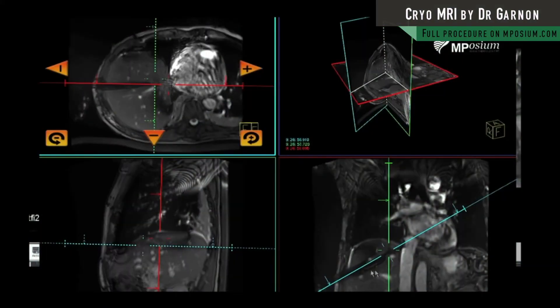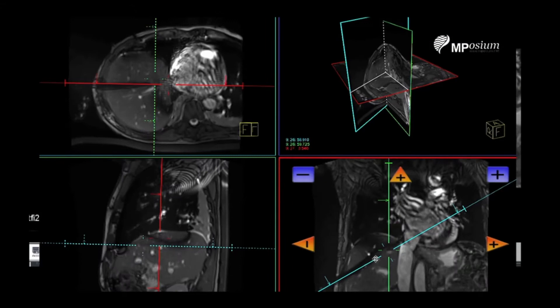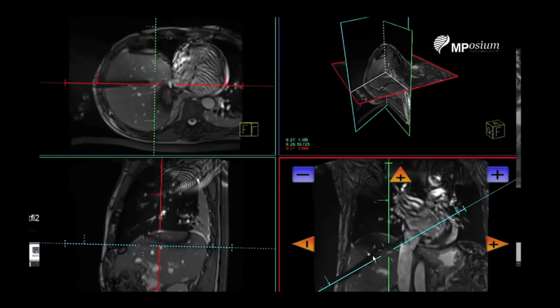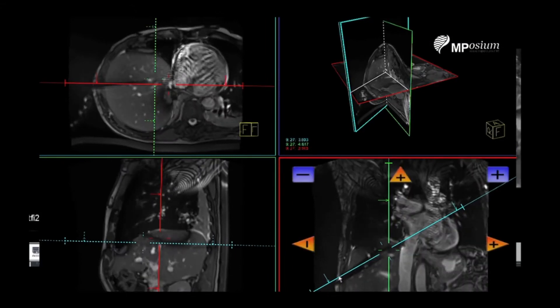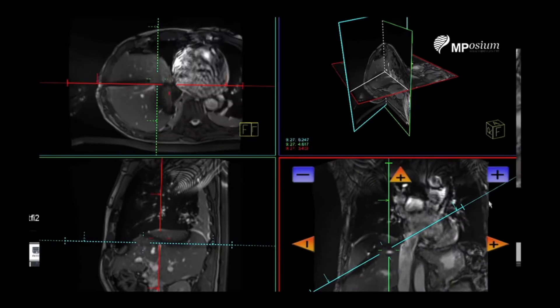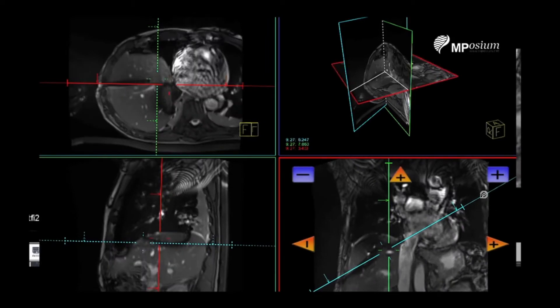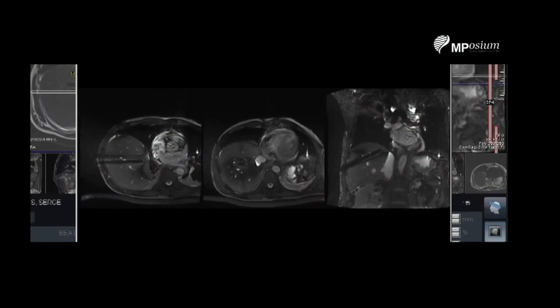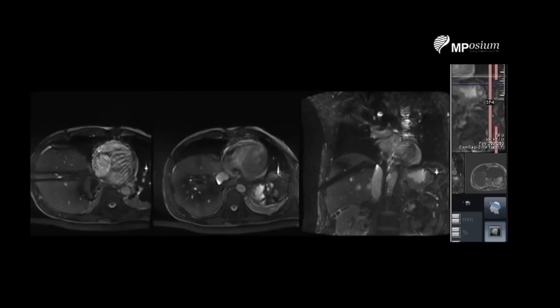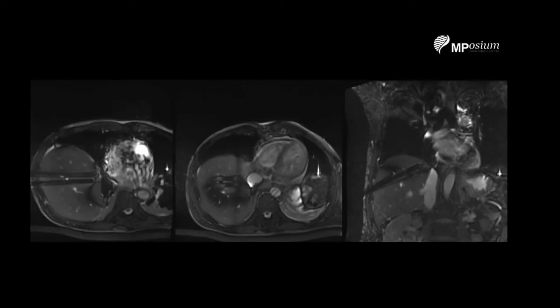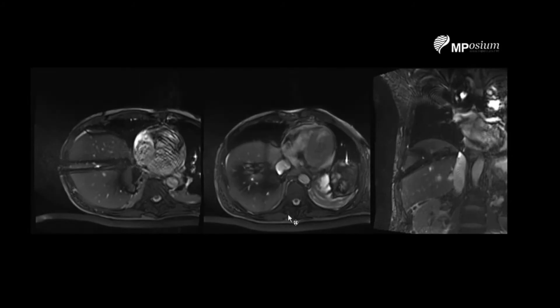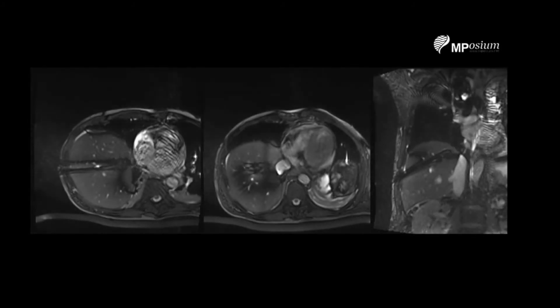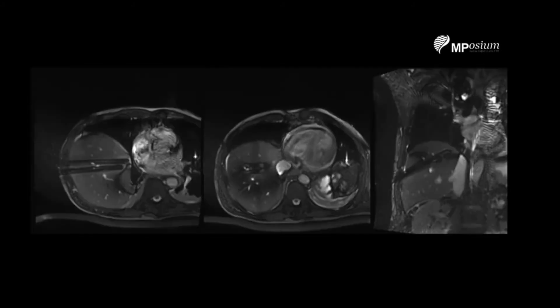The advantage of MRI is to provide a very safe puncture compared to ultrasound and CT scan, because you can see the vessels and you can see the target. The T2 blade sequence shows that we can advance the two needles one centimeter — we have more precision with the T2 blade sequence than with real-time imaging.